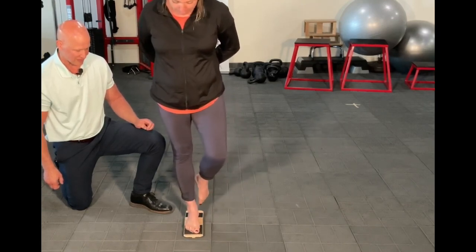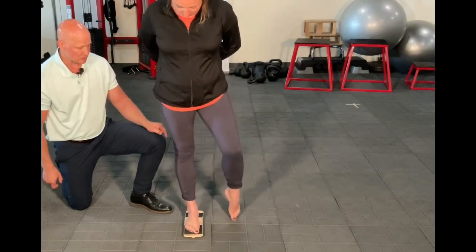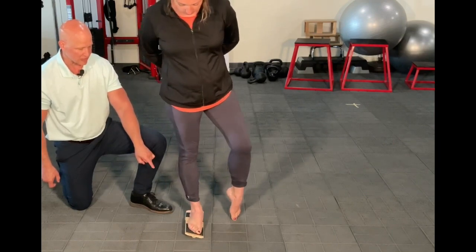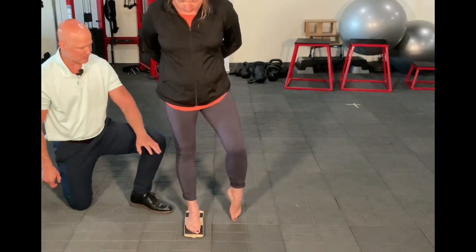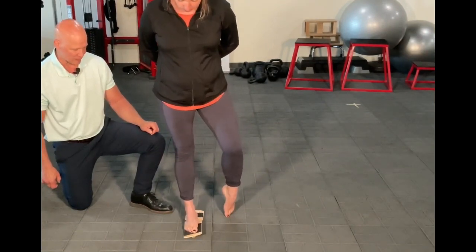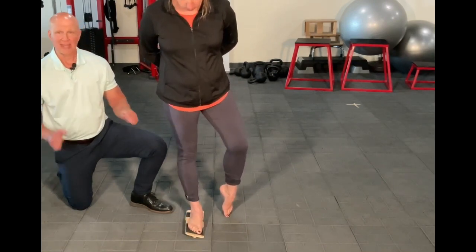Very hard. And again, I can barely toe touch, and I can work reps from here, inverted to center or everted back to center, back and forth. Okay, keeping all my weight on that guy. Yeah, really hard. Great, that's the Blackboard.